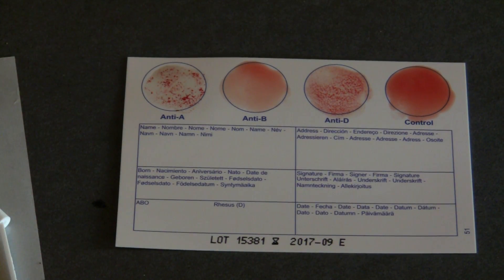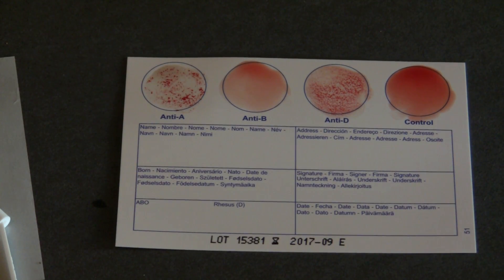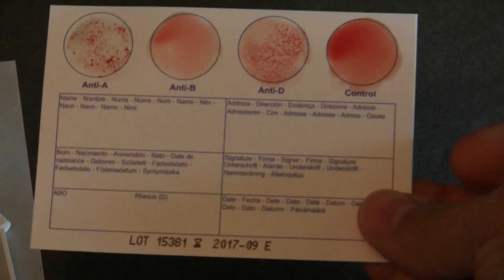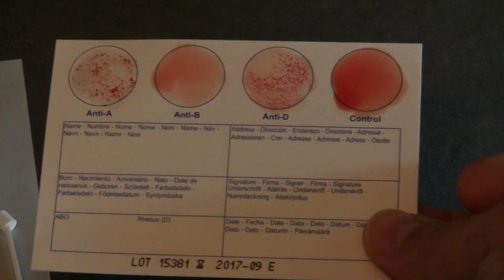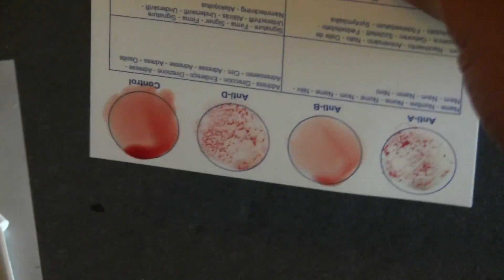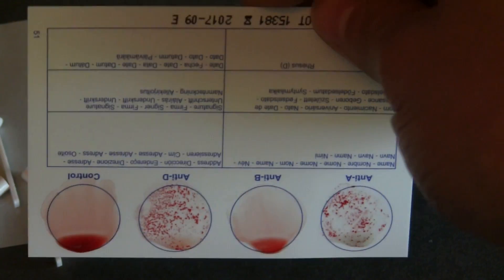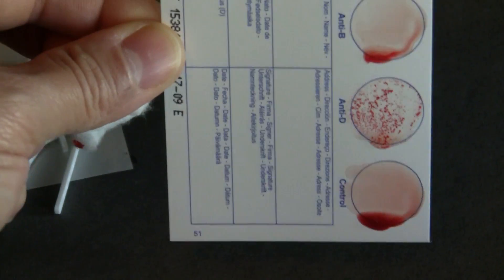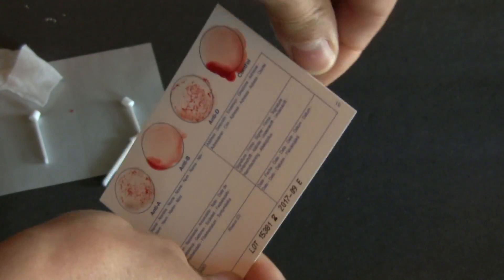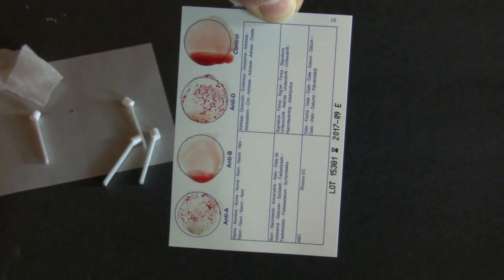So now, it says you wait 10 seconds, and then you hold it upside down. Is it upside down for 10 seconds? 1, 2, 3, 4, 5, 6, 7, 8, 9, 10. 1, 2, 3, 4, 5, 6, 7, 8, 9, 10. 1, 2, 3, 4, 5, 6, 7, 8, 9, 10.